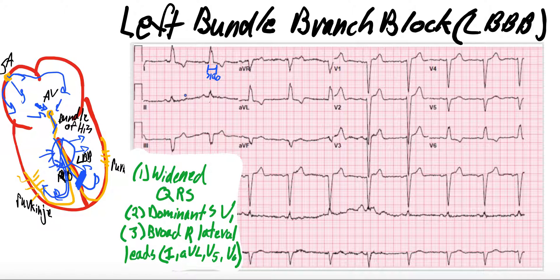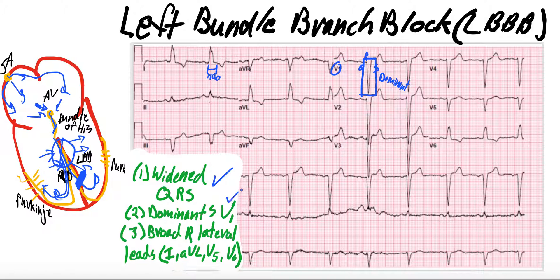In addition to that, we talked about this dominant S wave in V1. If we go to V1 here, we have our Q, then R would be up, and then this is S — you have this huge dominant S wave in V1. You can see that persisting through V2 and V3 as well. But specifically in V1, we get this dominant S wave. The dominant S wave in V1 is less thought about; usually we think about the widened QRS and then the broad R waves in the lateral leads.